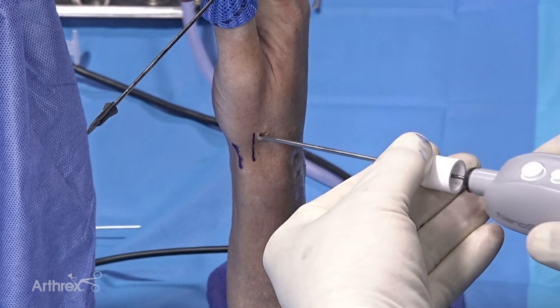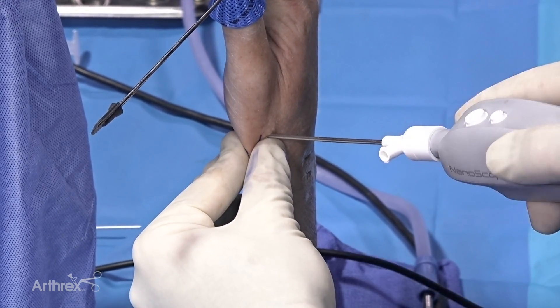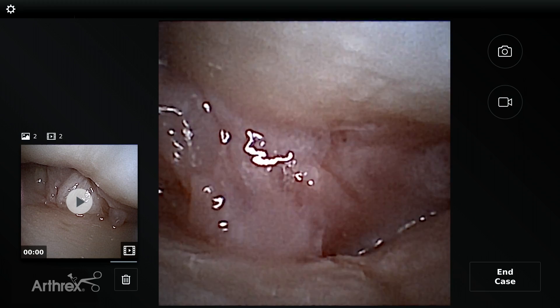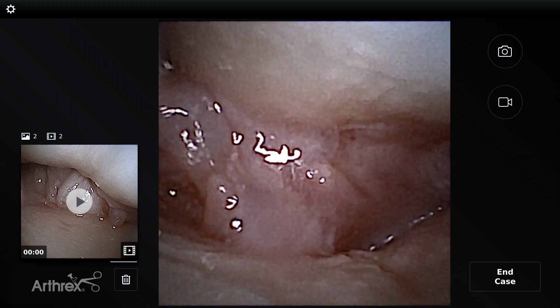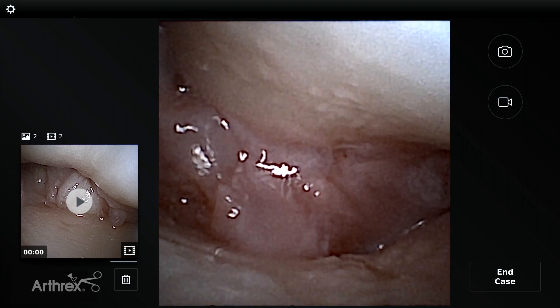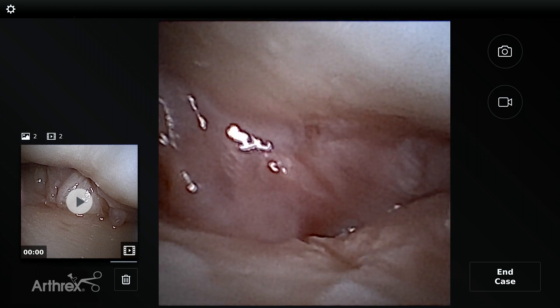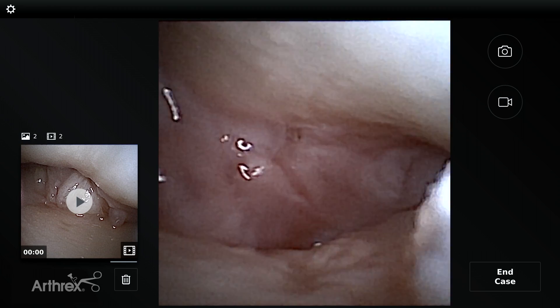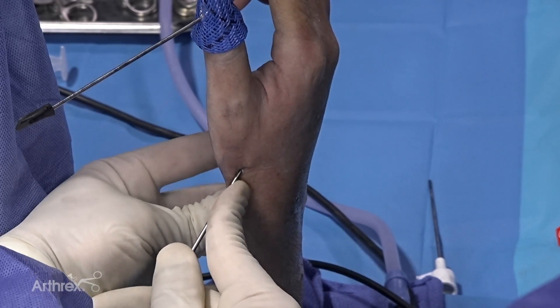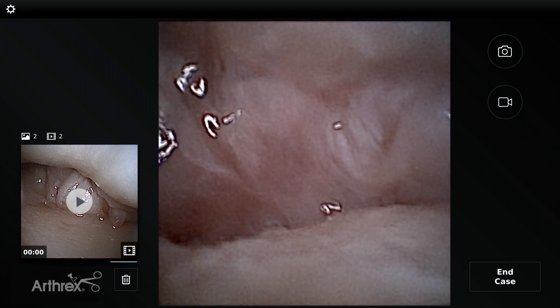Take our nanoscope — remember it's essentially a 12-gauge needle with a high-definition lens — and we're going to get into the joint. Now we're into the trapezometacarpal joint. Remember it's a saddle-shaped joint. You can see at the top is the base of the metacarpal, and now you can see the saddle of the trapezium.